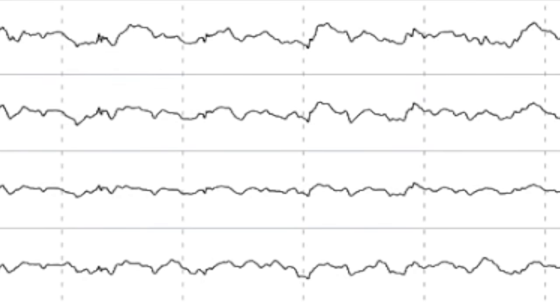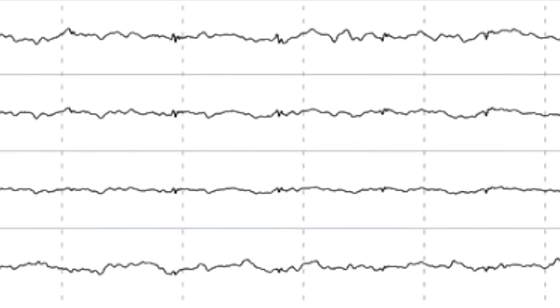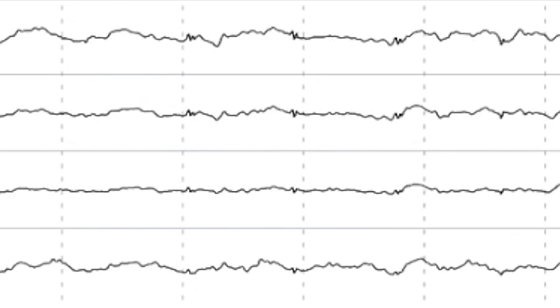When things are calm, the sound is actually just almost a background hum. When a seizure condition exists, there's no longer that calm background hum. It's very, very prominent, high amplitude, rhythmicity. You hear an intense sound, and you hear it kind of almost screaming.